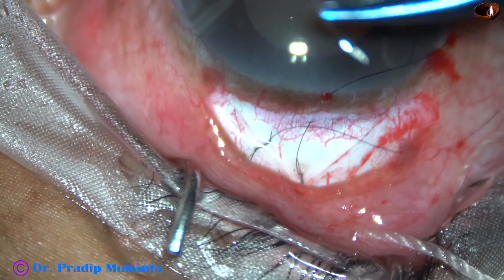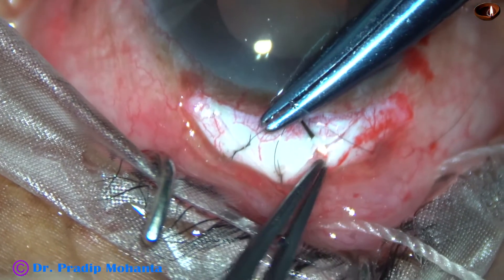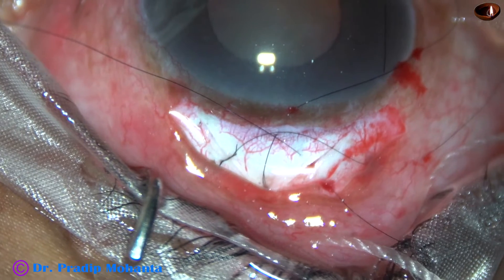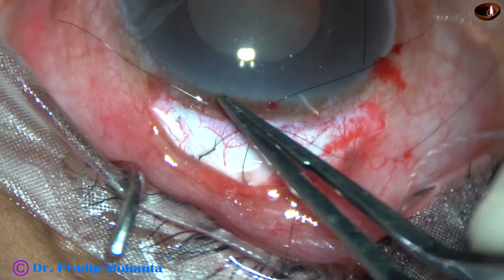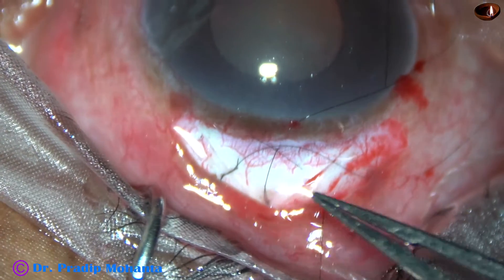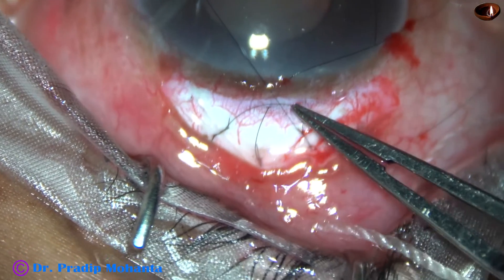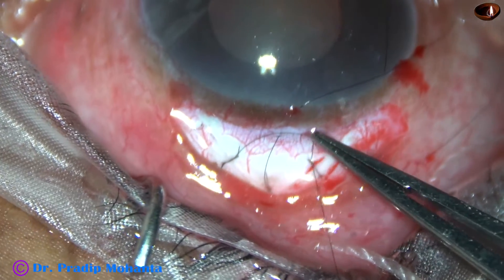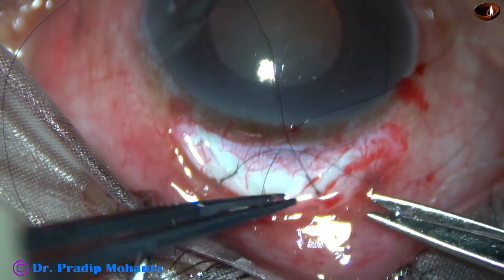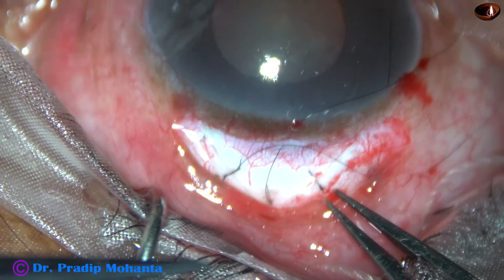This patient has been suffering from primary open-angle glaucoma for about two years. The IOP was not getting controlled by four molecules of anti-glaucoma medicines, and we decided to do this trabeculectomy. At least one suture on the scleral flap should be permanent so that the wound doesn't open up like a fish mouth. In this case I wanted more filtration, so I have put two releasable sutures.